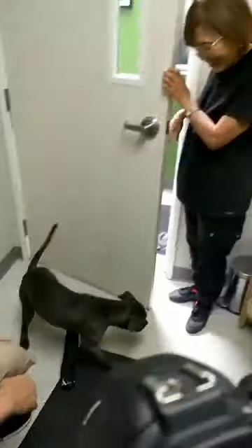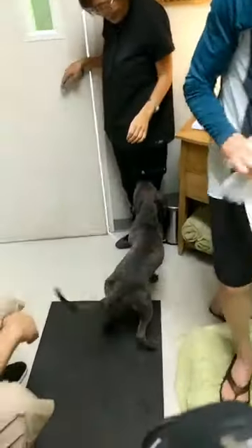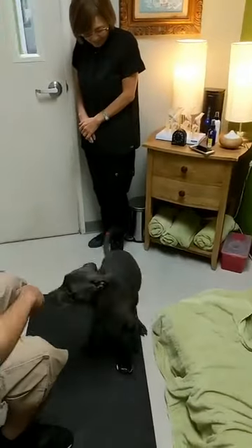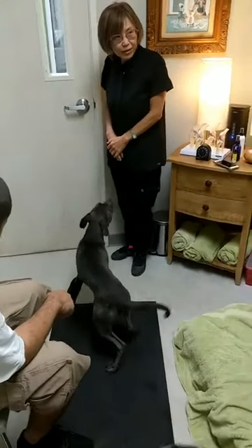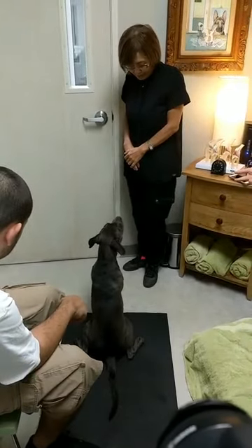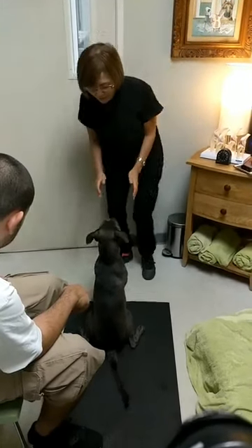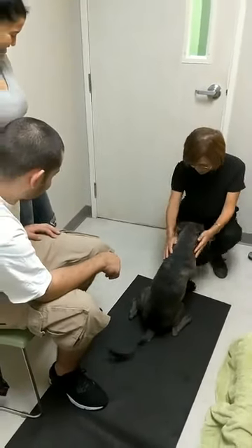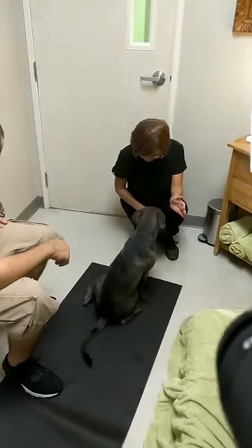Hi! How are you, Dr. Seplo? He got the new boots! Hey buddy — that looks like the best fit so far. Yeah, it's a good fit. It's holding his paw in a much better position and straightening his forelimb out. So the tail's a good one.